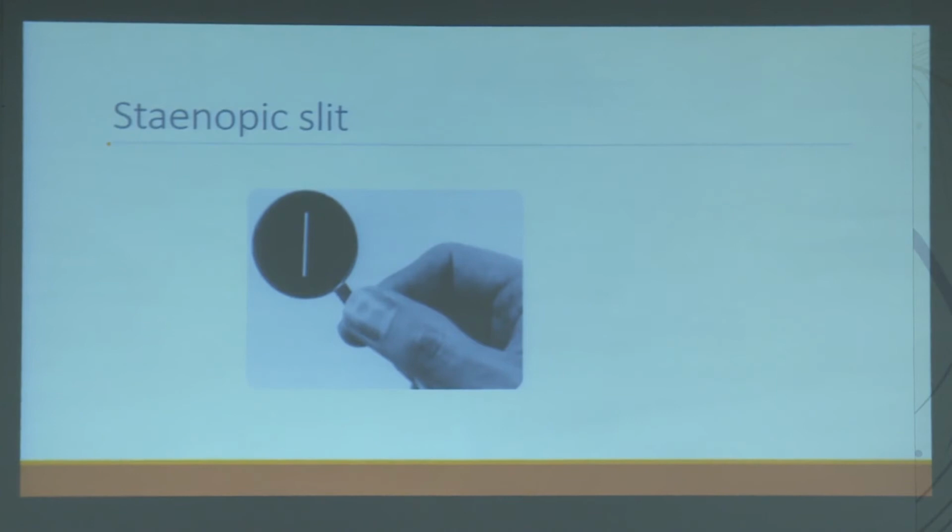And nowadays, for all the corneal ectatic problems, we have got topographers and also the high-end machines. So earlier, or even now, if you have no access to the high-end machines, the stenopic slit can be used in high astigmatism, keratoconus. Keratoconus, especially early keratoconus, maybe to assess the principal meridians, you can use a stenopic slit. Thank you.